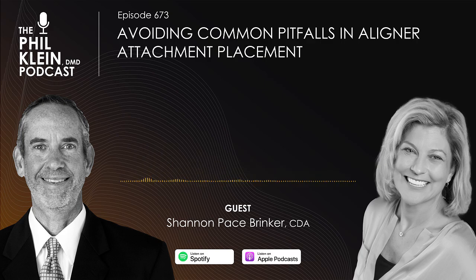And here's a key takeaway. Consistency matters. Using a cohesive system of products, especially the adhesive material and composite resin, can significantly impact the strength, longevity, and overall effectiveness of your attachments. So whether you're new to aligner therapy or looking to refine your technique, I think you will find a lot of information in today's episode that will help elevate your clinical success.